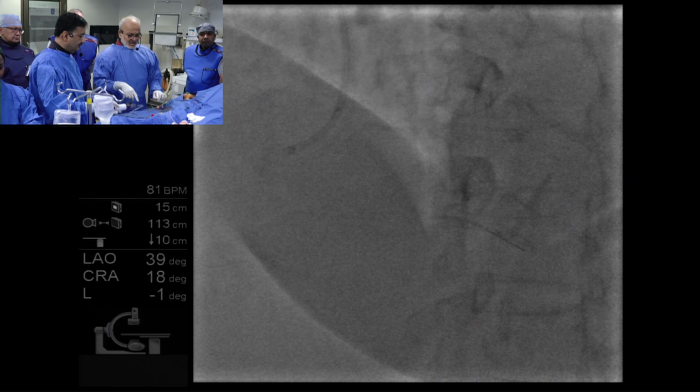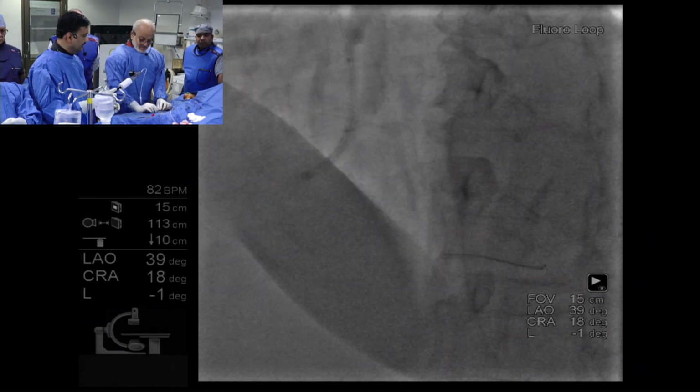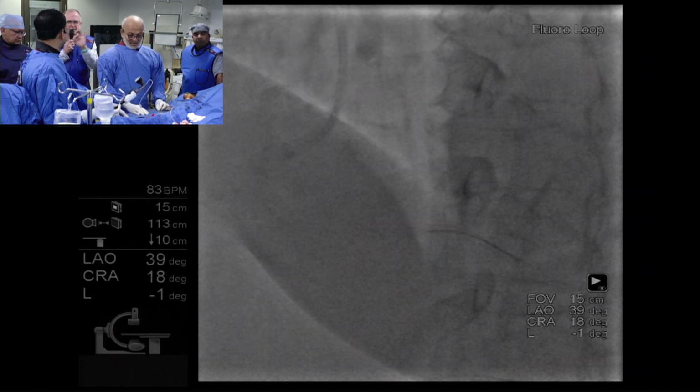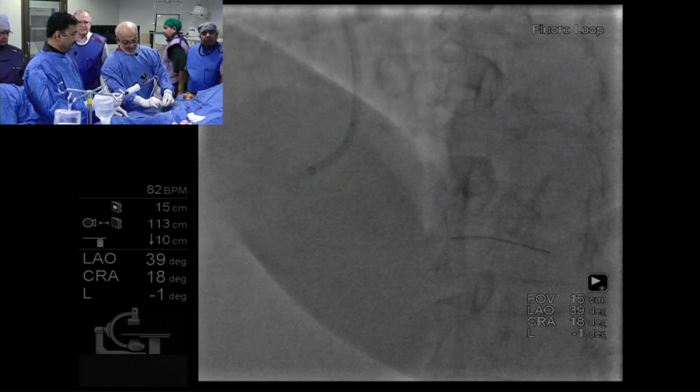Now he will deflate the balloon, and pressure will reappear. Okay, fine. I think one of the key safety things though is to make sure that you're bleeding back so there's no air. That's right. That's what I am doing. Lovely. Finish.